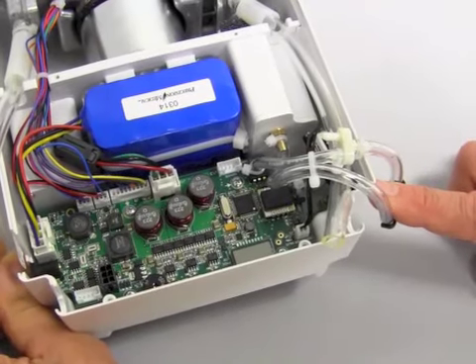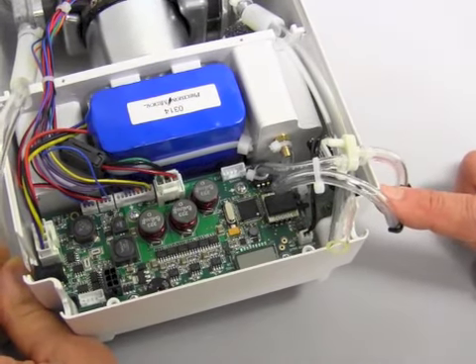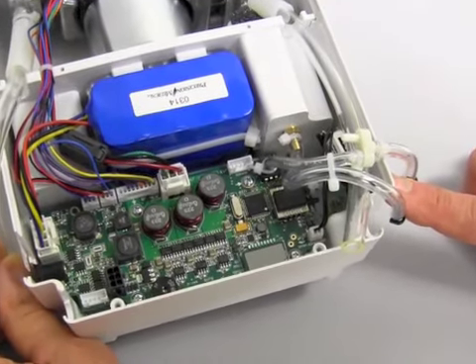This shows that all the plugs are back in place for the circuit board. And please note also that we have now plugged the valve back into the top corner of the circuit board.